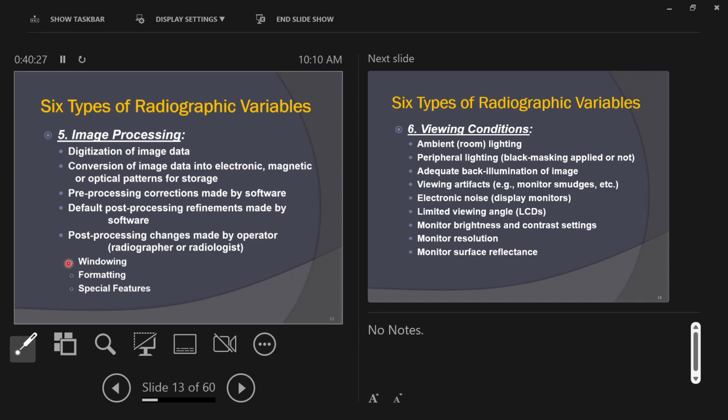I should give you one little point of caution with windowing. When you window an image, you are taking away information from the image. Once you window and save what you've done, you've changed that image permanently. The radiologist can't go back and unwindow. Once you do the windowing action, it's done, and the people who are going to diagnose will have less information to work with, so you better make sure you know what you're doing if you decide to window an image. Taking away information is good in some circumstances, but take away too much, that's not good. If you window in the wrong way, making an image too low contrast when it should be higher contrast, you're going to upset some radiologists or physicians, and that's not a good thing.